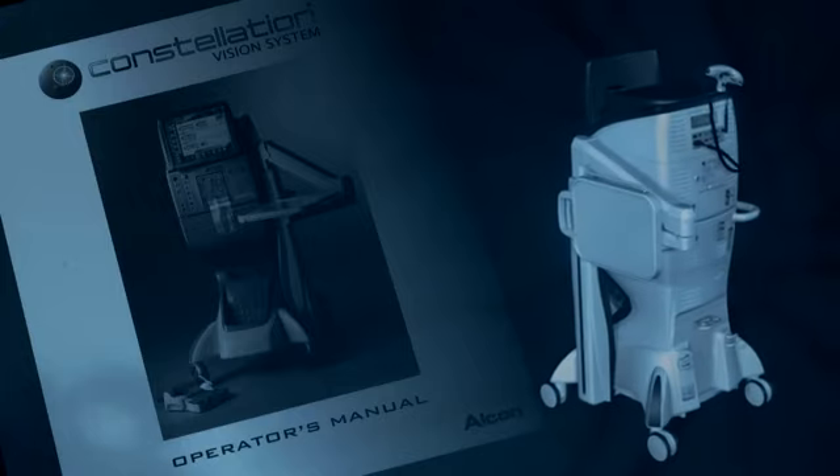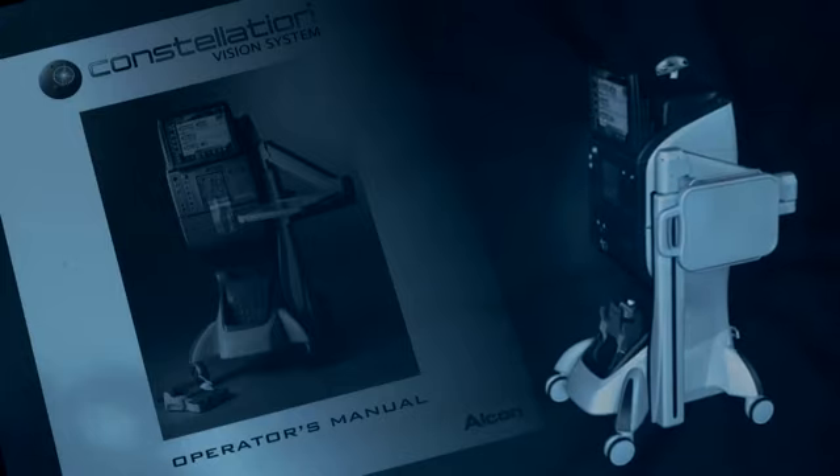For more detailed instructions, please consult the operator's manual or the directions for use.